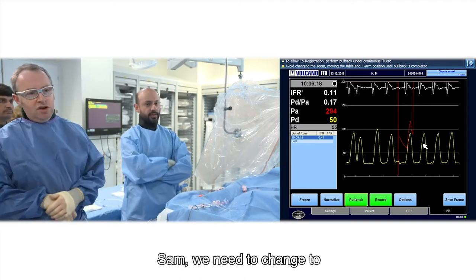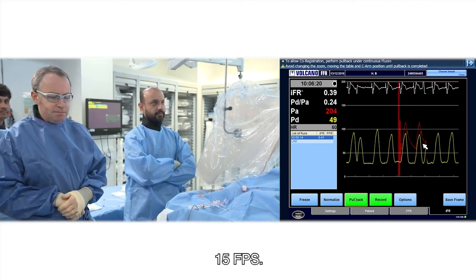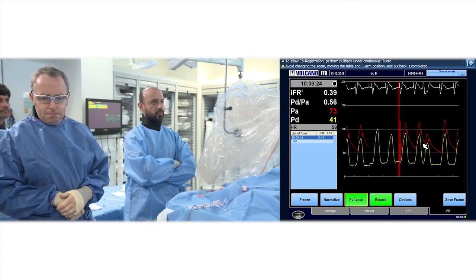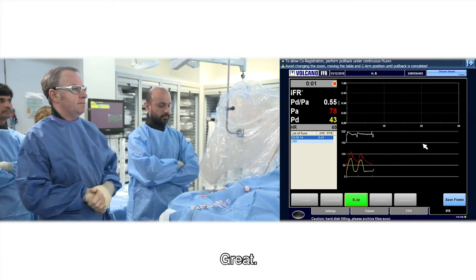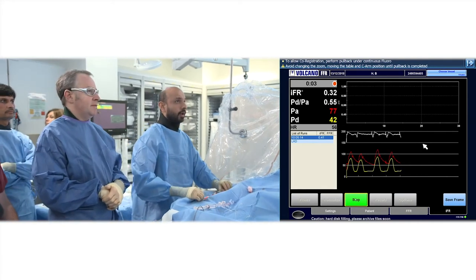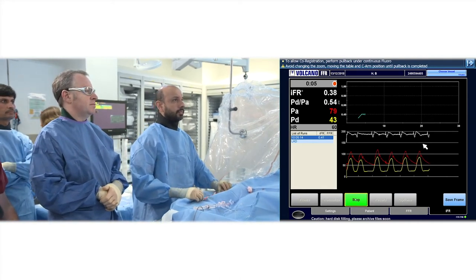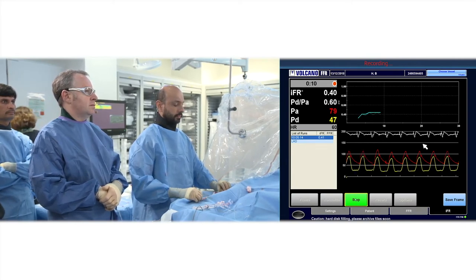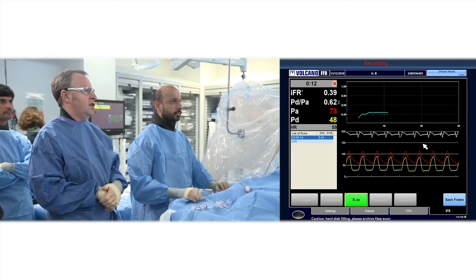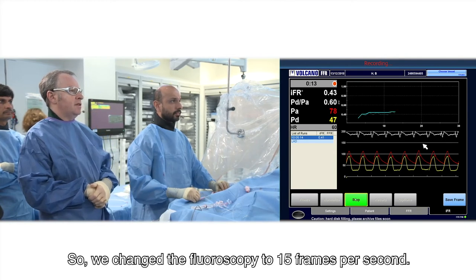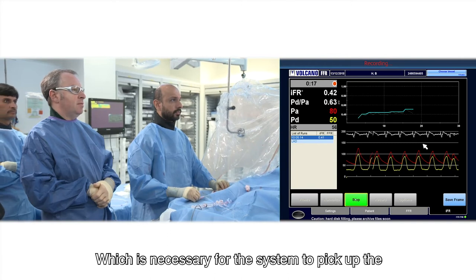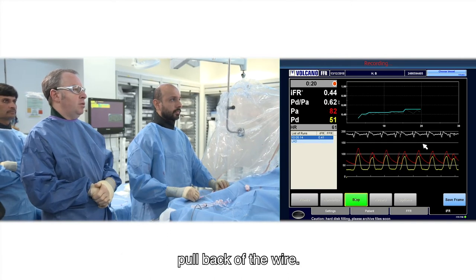Sam, we need to change the 15. Great. So we changed the fluoroscopy to 15 frames per second, which is necessary for the system to pick up the pullback of the wire.